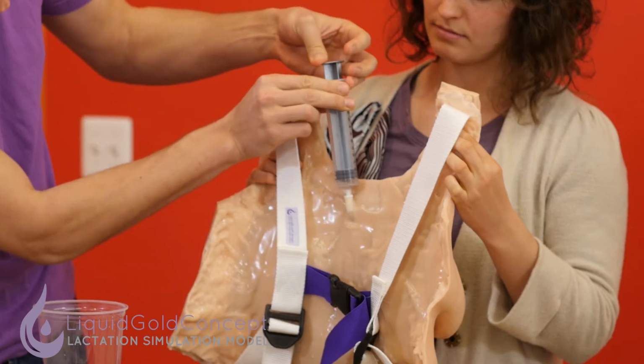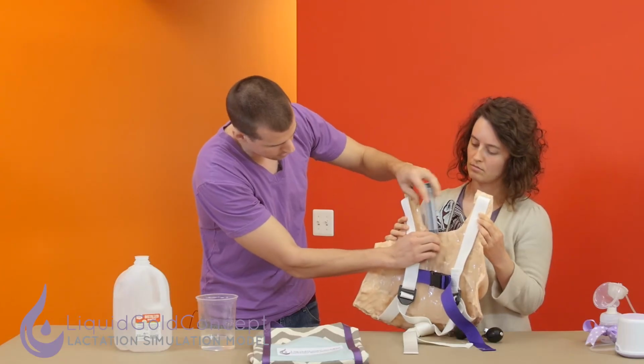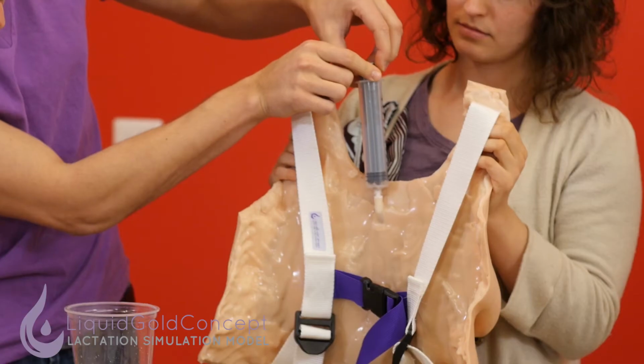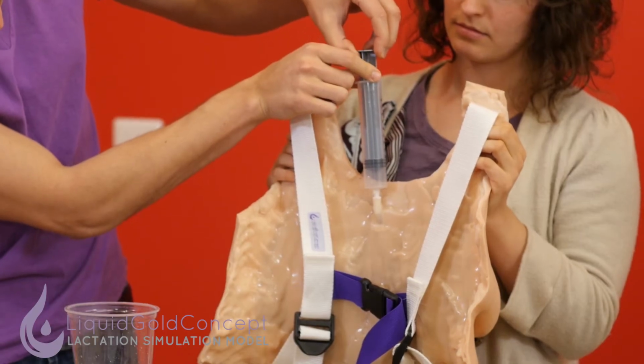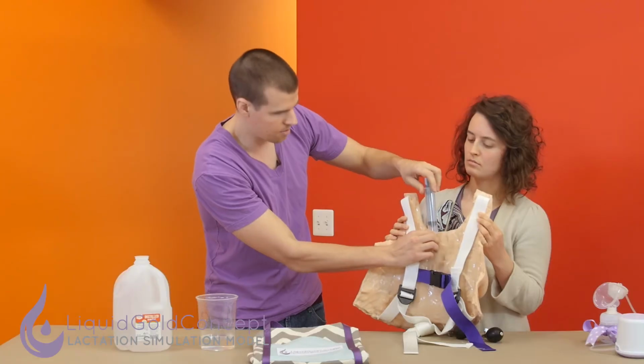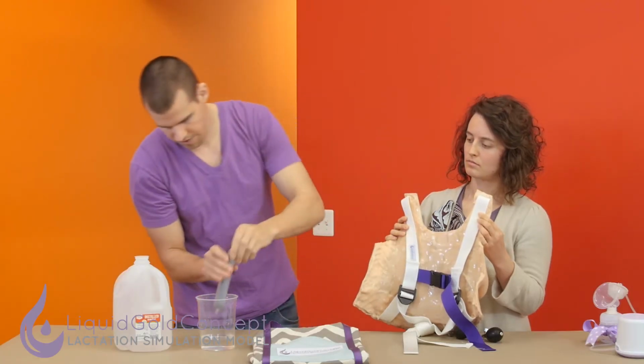So I'm gonna insert the water in, and before I take this out, what I typically do is I actually pull back on the syringe, and if I pull back and I see air, then I know that it's not yet full and I can keep going. So we'll fill it up again.